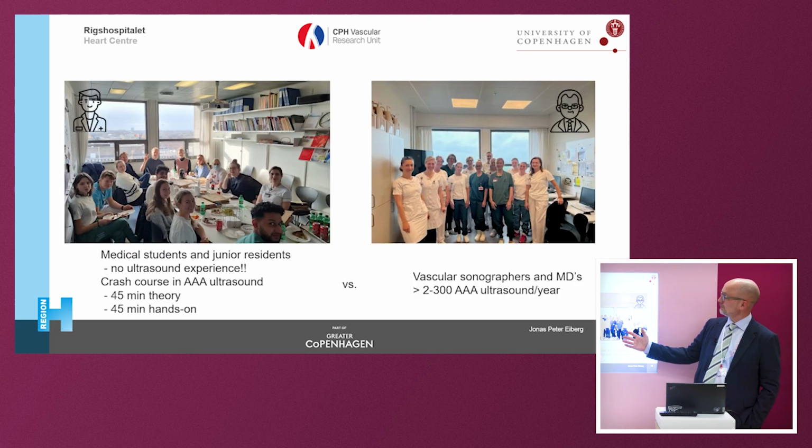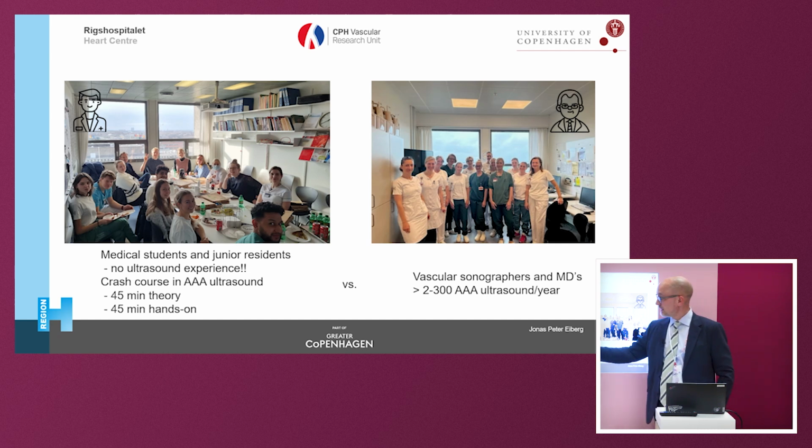So we have 2 groups of ultrasound operators. This team of very experienced vascular sonographers, they do 200 to 300 abdominal ultrasound examinations per year, only looking for abdominal aortic aneurysms. And then there was this group of happy medical students with no ultrasound experience.